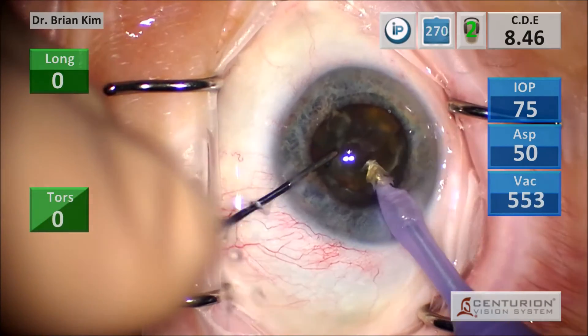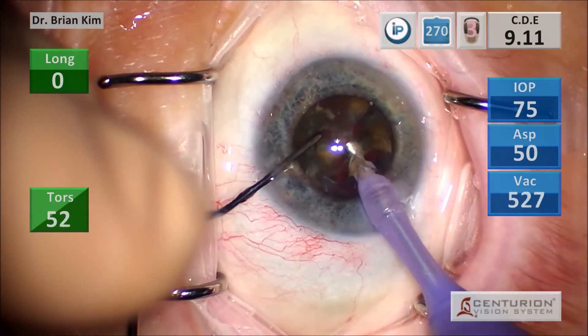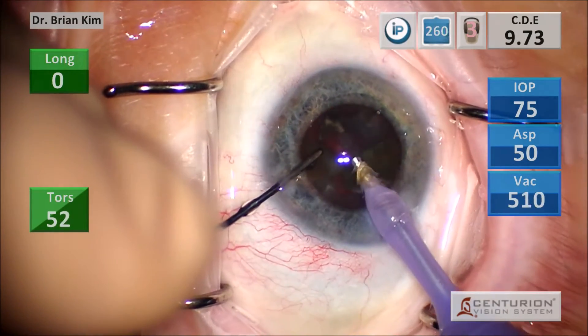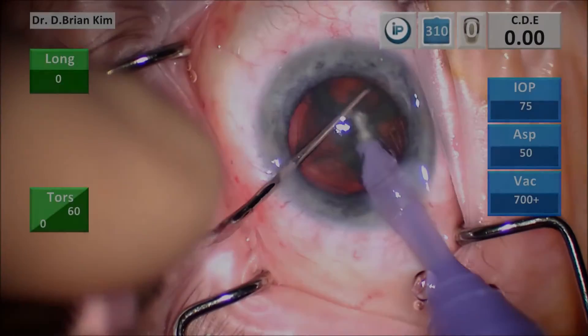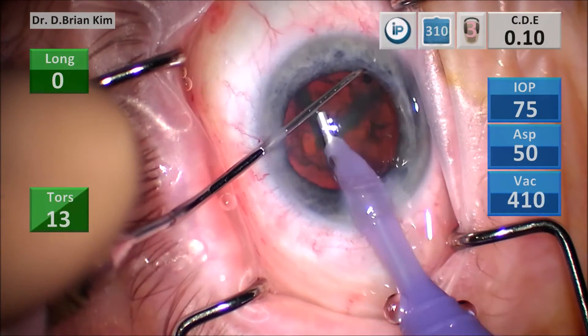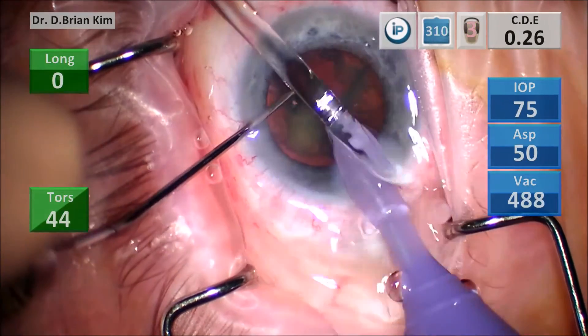After cross chop, freeing that first piece was difficult, so I went ahead and tried chopping again and the fragment became mobile. Don't be afraid to re-chop if you find yourself having difficulty mobilizing. Again, after cross chop, the first quadrant won't come out, so I just pull it centrally without difficulty.